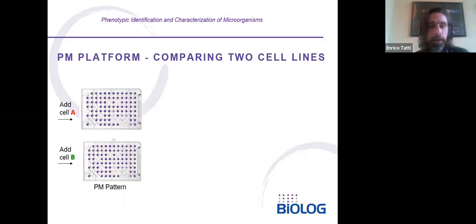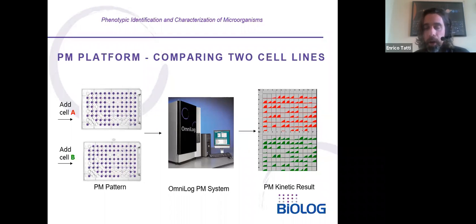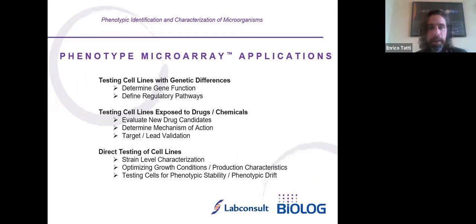So very, very powerful. And just to conclude, this technology has been used extensively now. It was developed in the early 2000s, initially for comparing two different cell lines or two different conditions with the software and seeing immediately the metabolic differences.